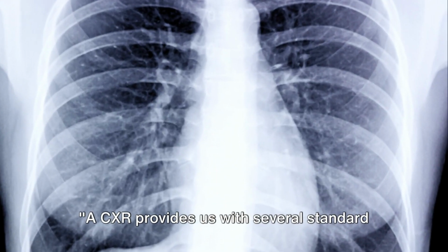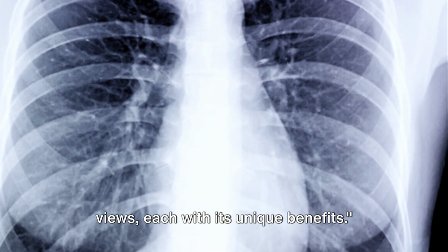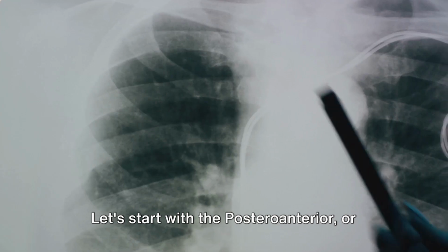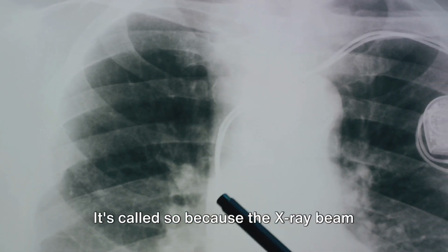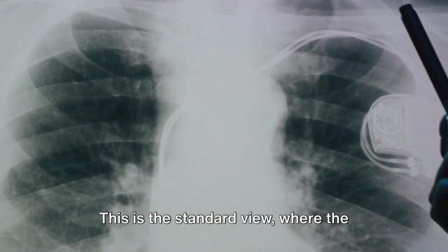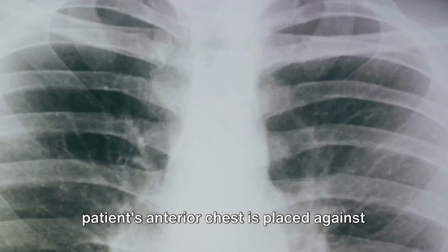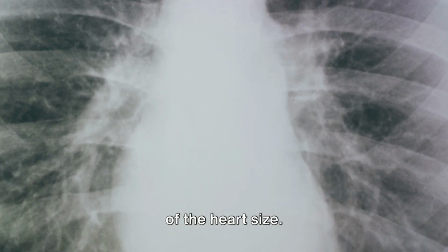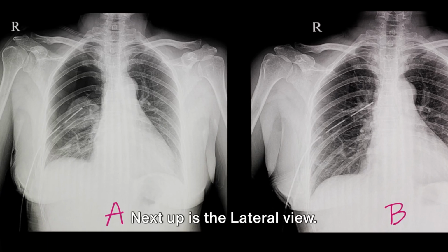A CXR provides us with several standard views, each with its unique benefits. Let's start with the postero-anterior, or PA view. It's called so because the X-ray beam travels from the back to the front. This is the standard view where the patient's anterior chest is placed against the film plate to minimize magnification of the heart size. Next up is the lateral view.